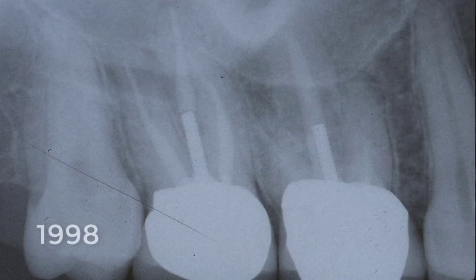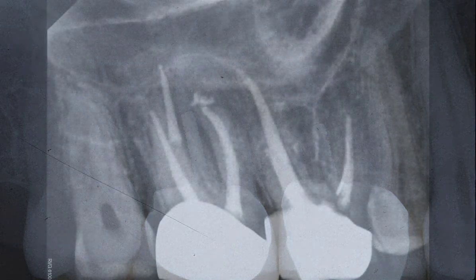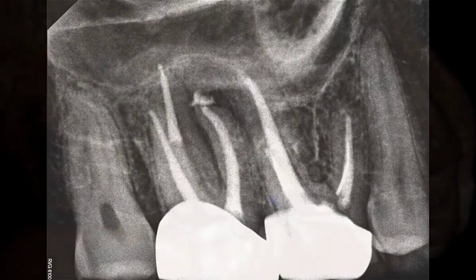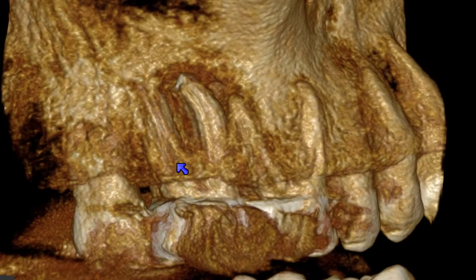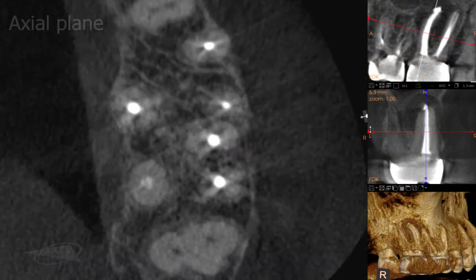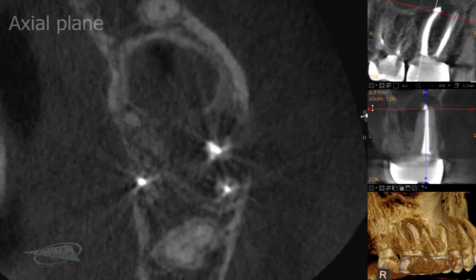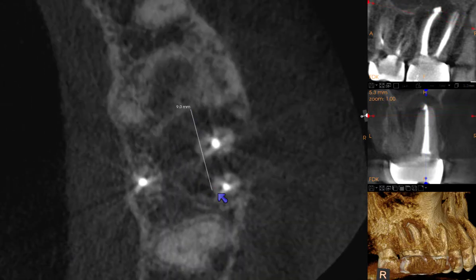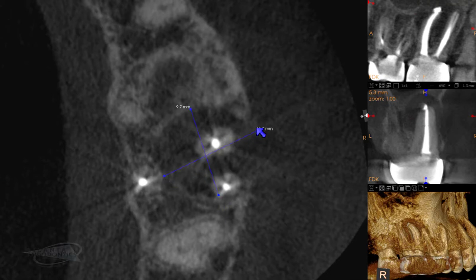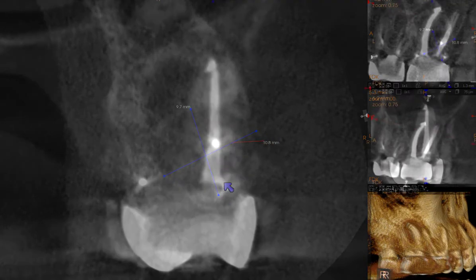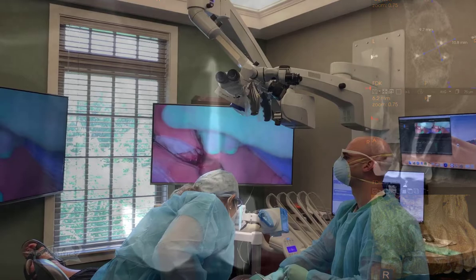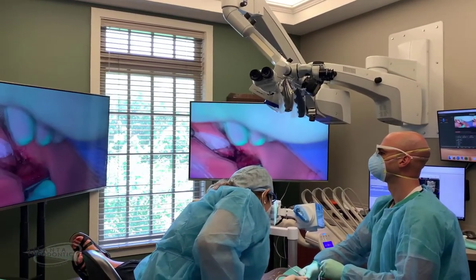In 1998 this tooth was treated by an endodontist. After retreatment in 2020 by a second endodontist, a large periapical finding persisted, which you can see highlighted on this 3D image. We can appreciate on the CBCT the intact crestal bone and furcation area on tooth number two, and we can precisely measure the size of the lesion on the mesial buccal root. The coronal plane shows the large lesion breaking the buccal plate.